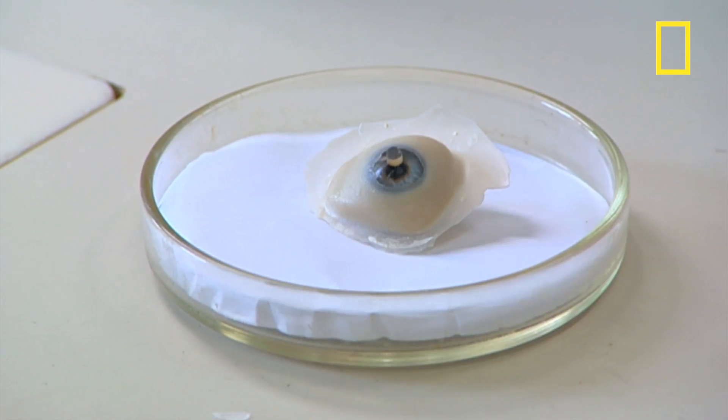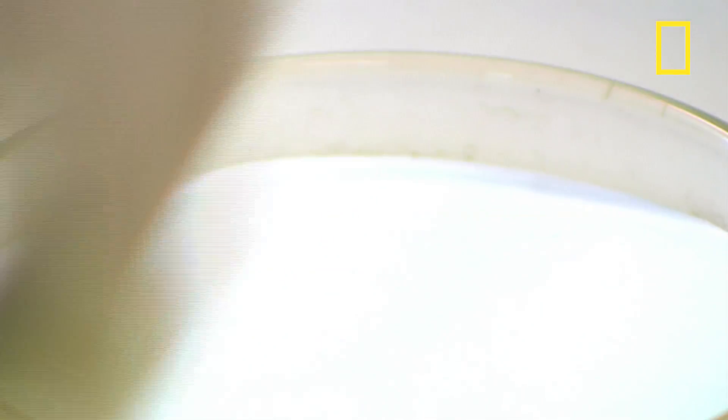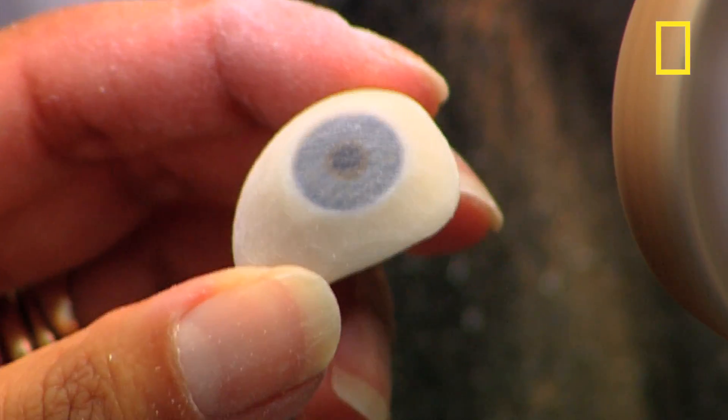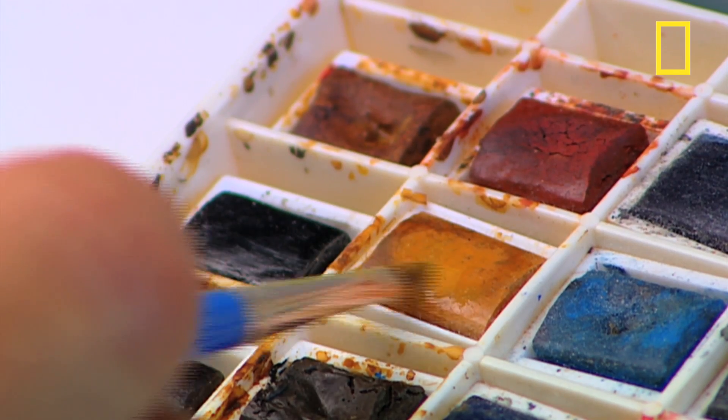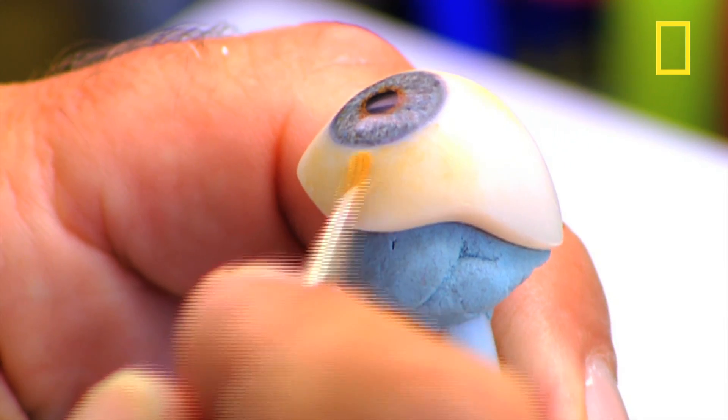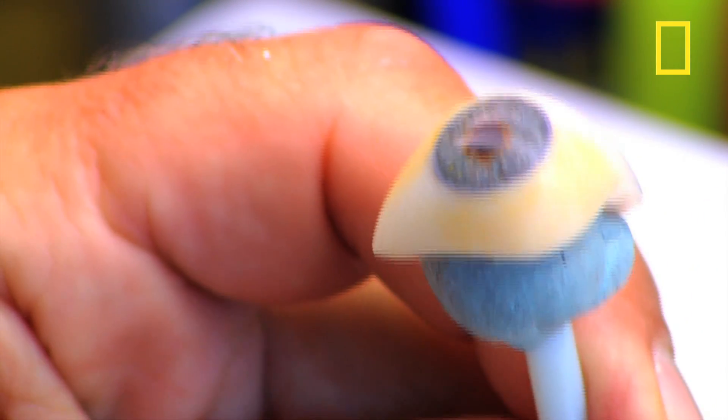The eye is now starting to take shape. The excess acrylic material is trimmed away on a grinding wheel and the eye gets stained and veined. The average human eye isn't snow white so a bit of watercolor paint is dabbed around the edges depending on the patient's natural color.